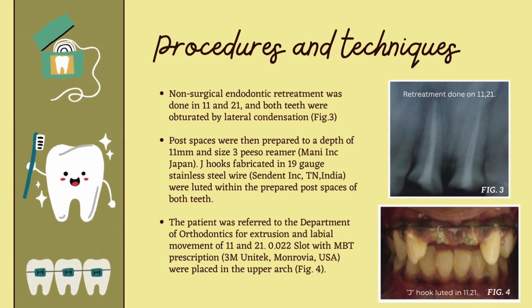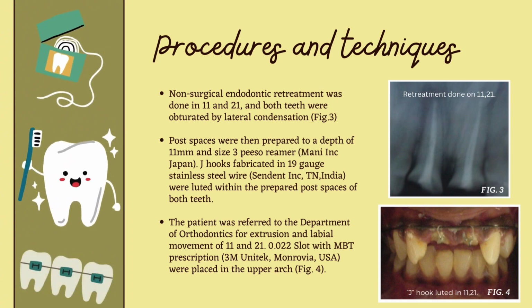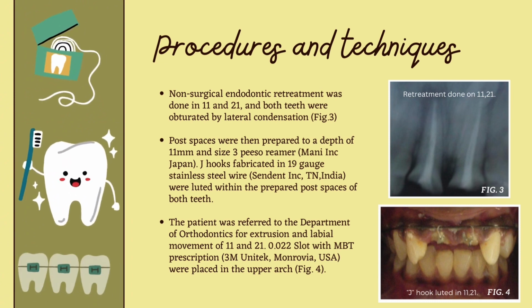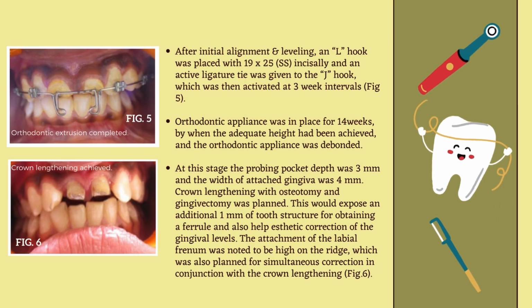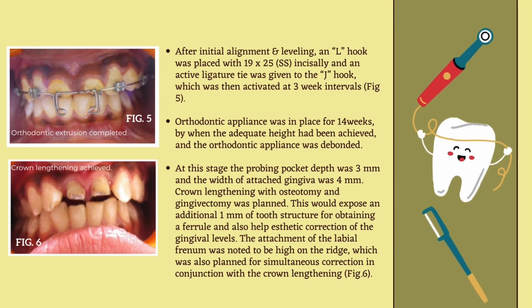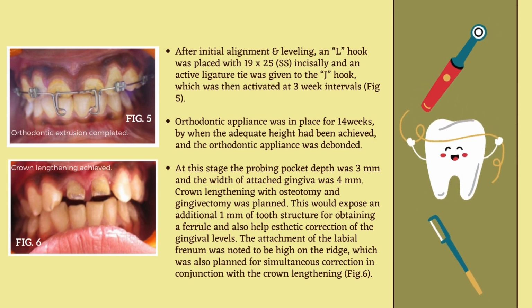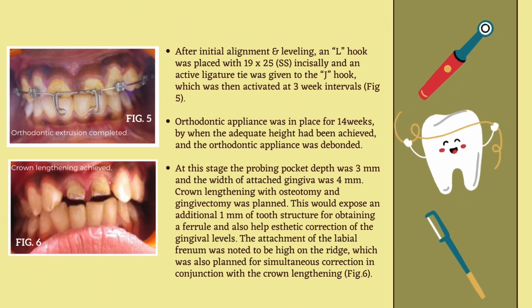0.022 slot with MBT prescription, 3M Unitek, Monrovia, USA, were placed in the upper arch, Fig. 4. After initial alignment and leveling, an L-hook was placed with 19x25 SS incisally, and an active ligature tie was given to the J-hook, which was then activated at 3-week intervals, Fig. 5.